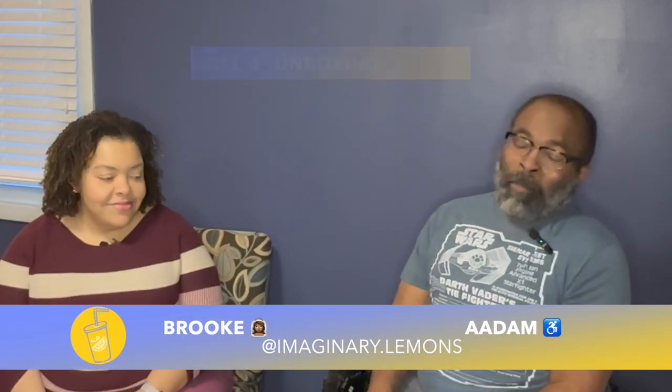Today we're going to do an unboxing and quick review of the Will Model F Power Folding Wheelchair. If you've watched any of my previous videos, you know that my primary wheelchair is a Will Model CI.